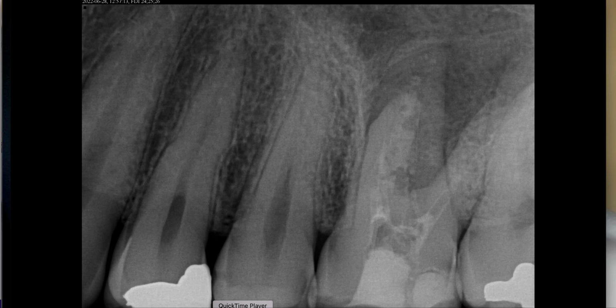I'm not trying to show off. The point was that this resin, if I was going to leave this for 6 months, is going to wear down quite a bit, and I do not want any leakage into this.